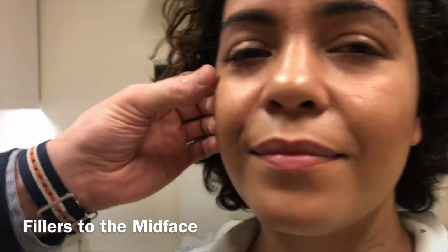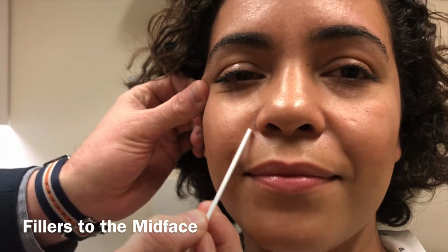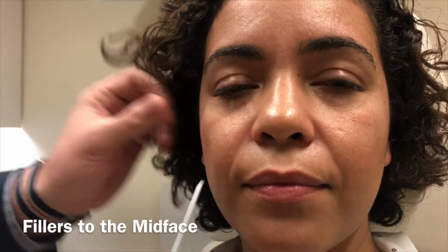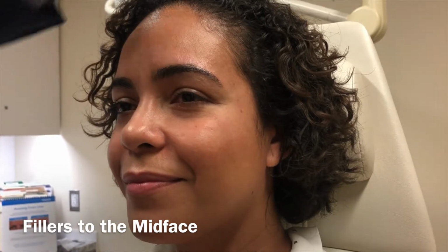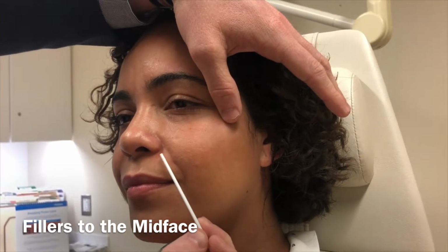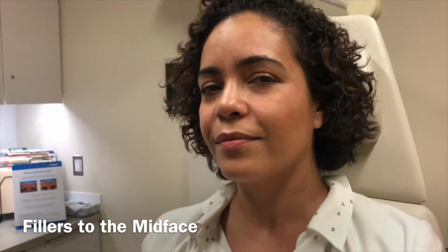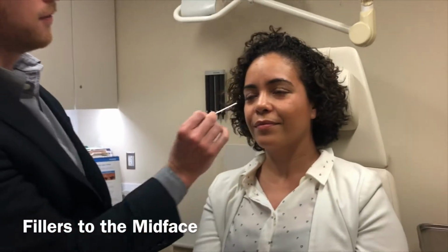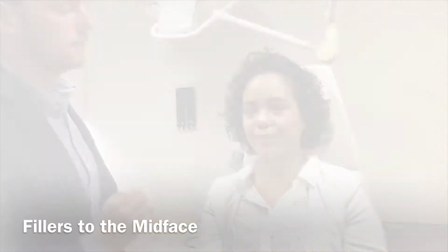If you look right here on the right side, this is helpful to raise up the cheeks a little bit, and it can help to efface this wrinkle right there. And same thing on this side. Not a very prominent wrinkle. She's already got a lot of facial volume here, but if you could raise that up, add some volume right in this area right there, it can efface that wrinkle without giving the sort of swollen look that some fillers can provide. So we're gonna start with the filler right in this area, and then Botox up here, and then Botox right there.